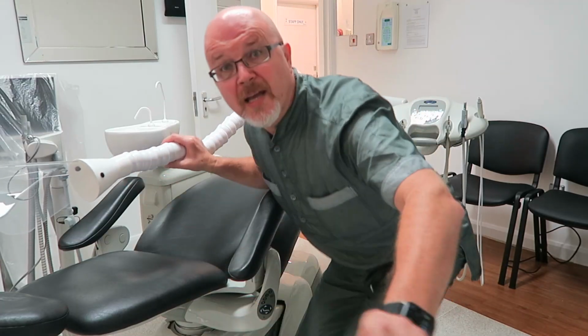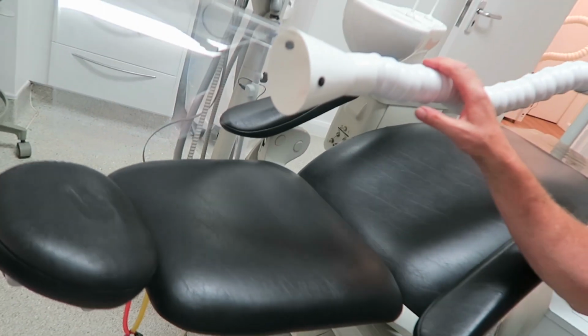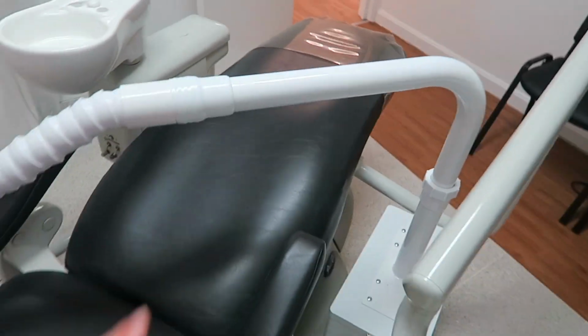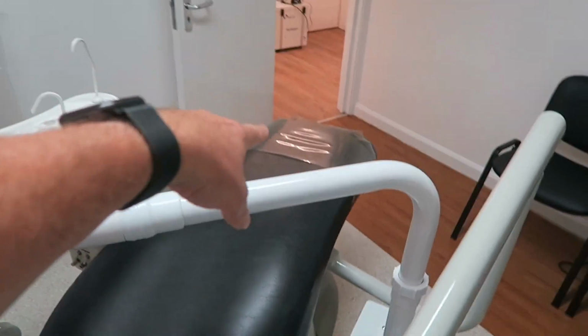Okay, so here we have it. This is now at a height where that could actually go over the patient's face. So shortly, obviously, this will have an extension tube, so it can go down there, which is where I would really want it.